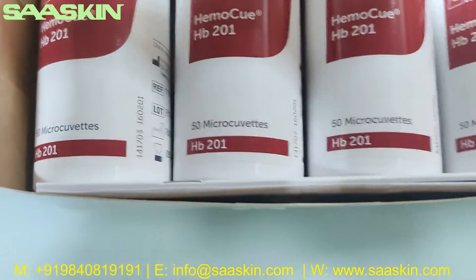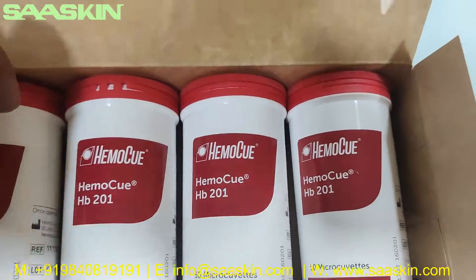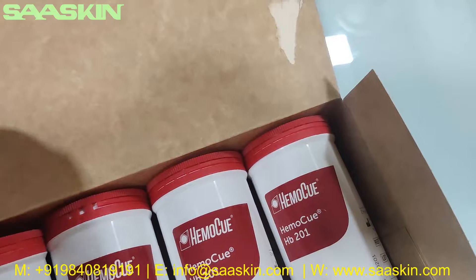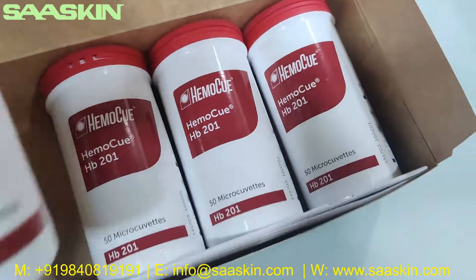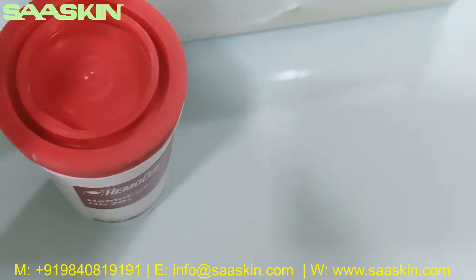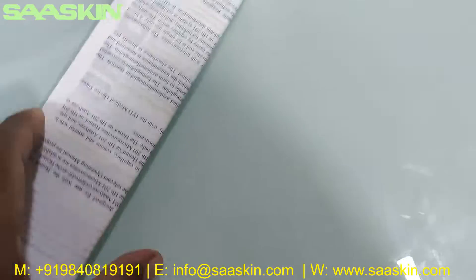Inside the box you have 200 micro cuvettes total. Each of these sub-boxes contains 50. So inside the main box there are four boxes, and you also get an IFU brochure with the complete instruction manual, which is taped inside.